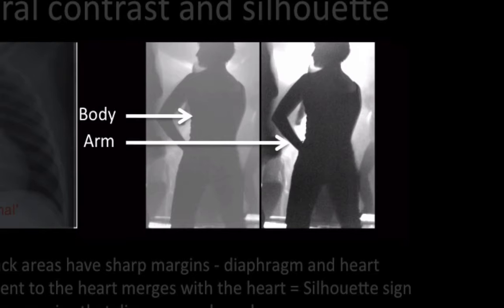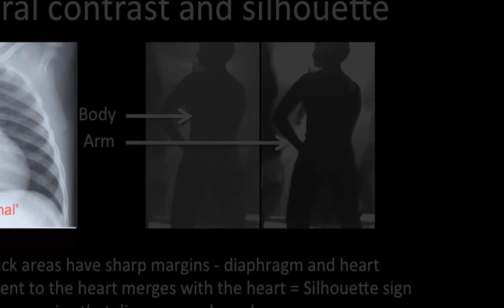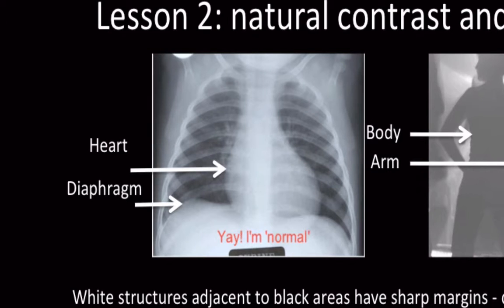I always tell students that you should be able to take a pencil and draw the outline of the heart and the outline of the diaphragm. The slide shows the cardiac margin and the diaphragmatic margin lying adjacent to very black, aerated, healthy lung. These margins — the silhouettes — are very clear and easy to see. When there's pathology, these margins become indistinct or are obliterated altogether.